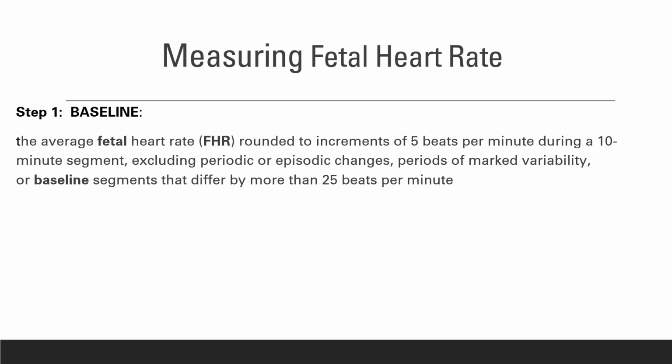Usually if they are early in their fetal gestation, they're more tachycardic. As they become term, they start to normalize in the 110s, and again, every baby has a different baseline. So first and foremost, you want to be able to establish your baseline.